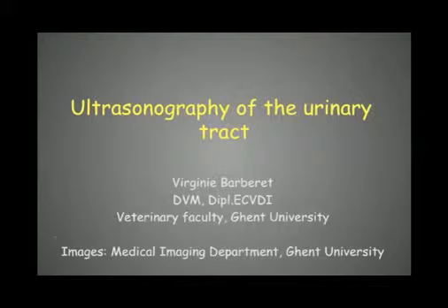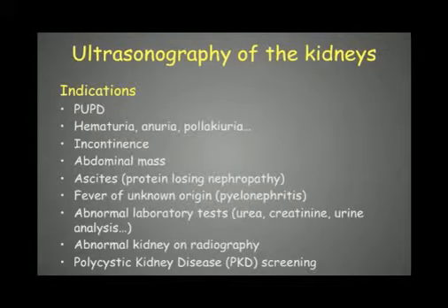In this presentation, we will see the ultrasonographic examination of the urinary tract of dogs and cats. So first, we'll start with the ultrasonography of the kidneys. There are a lot of indications to look at the kidneys and see if there are lesions of the kidneys with ultrasound. First, the most common one is PUPD, of course.